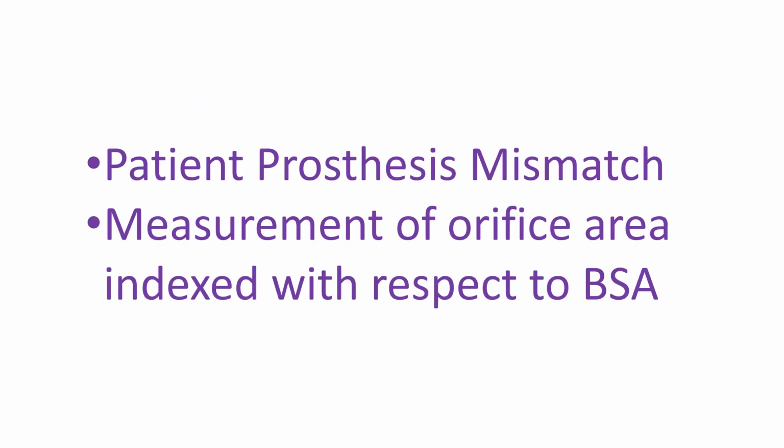While planning echocardiography for suspected prosthetic aortic valve obstruction, date of surgery, type and size of the prosthetic valve used, blood pressure, heart rate, height, weight, and body surface area are to be checked. Body surface area is needed to identify potential patient-prosthesis mismatch, which is most likely in case of aortic valve replacement than in case of other valves.